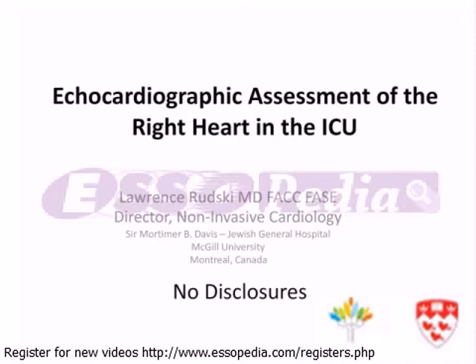Echocardiography is assuming an ever-increasing role in the management of patients in the intensive care unit. It's used in the diagnosis of the cause of shock or hemodynamic instability, etiology of respiratory failure or hypoxemia, the follow-up of patients to determine their prognosis, and in prognostication of patients.